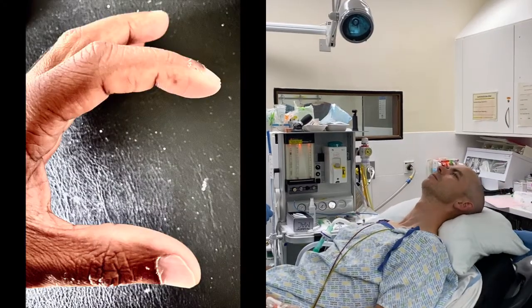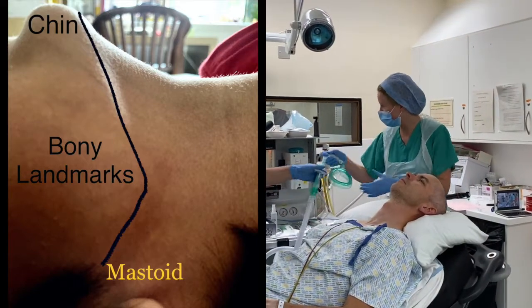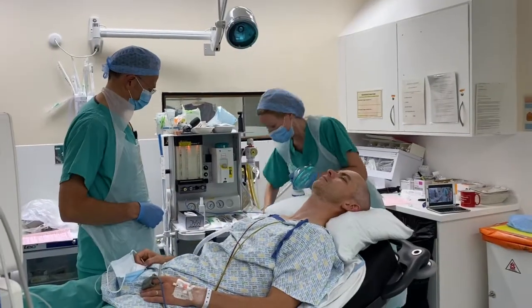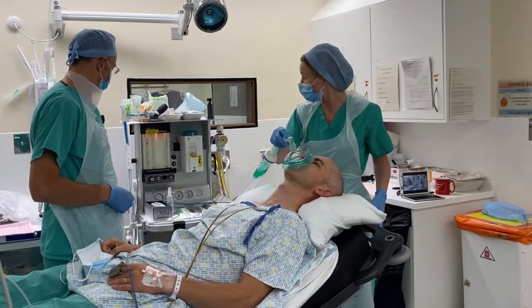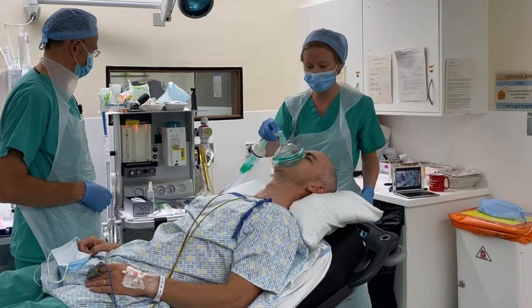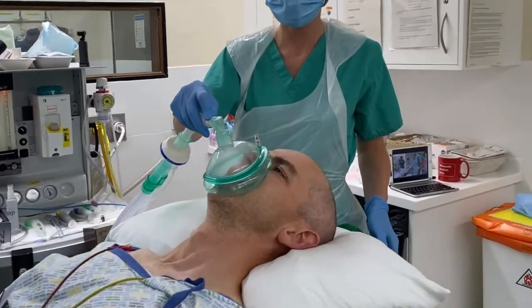Make a C shape with your index finger and thumb to hold the mask, with your remaining three fingers placed on the bony structure of the patient's jaw rather than compressing submandibular soft tissue. Avoid pressing the mask into the patient's face, as this is not only uncomfortable, but a poor technique. Gently pull the face up into the mask and make subtle adjustments with different hand positions to provide a good seal. You can confirm adequate seal by several methods.